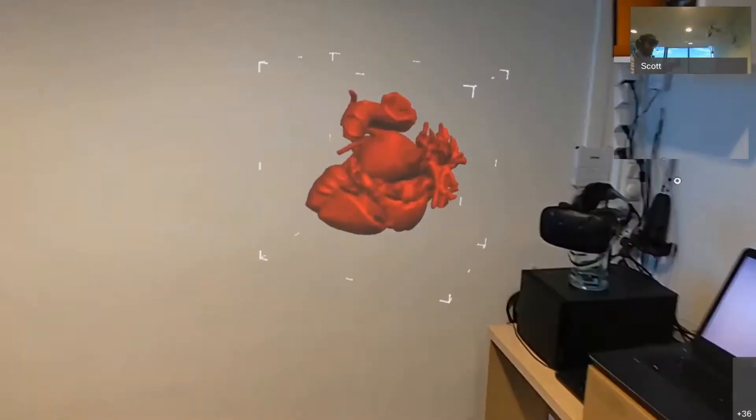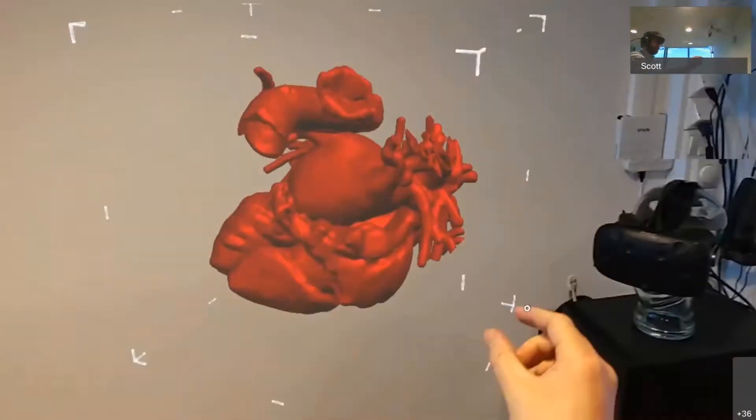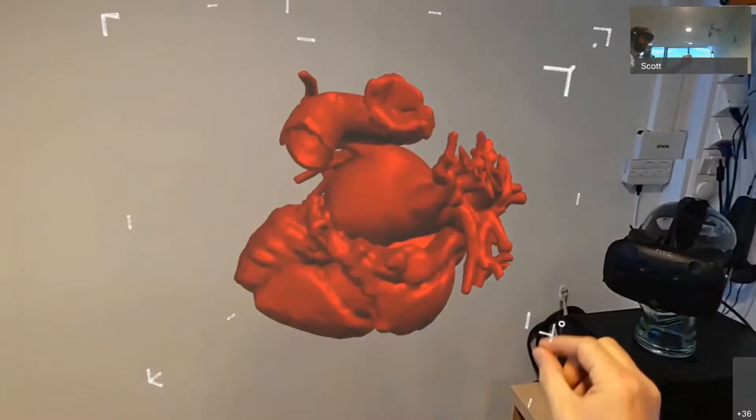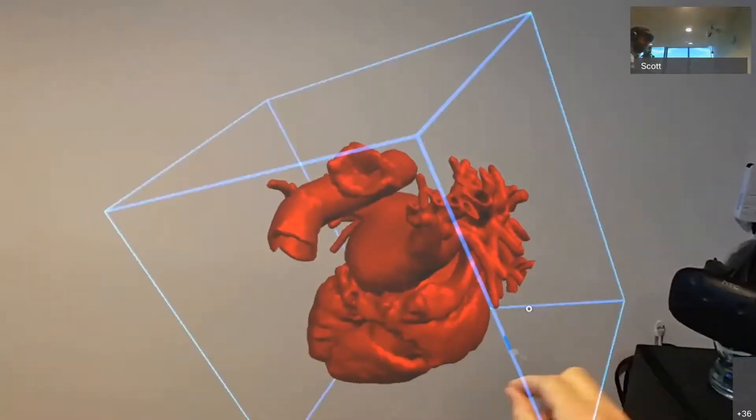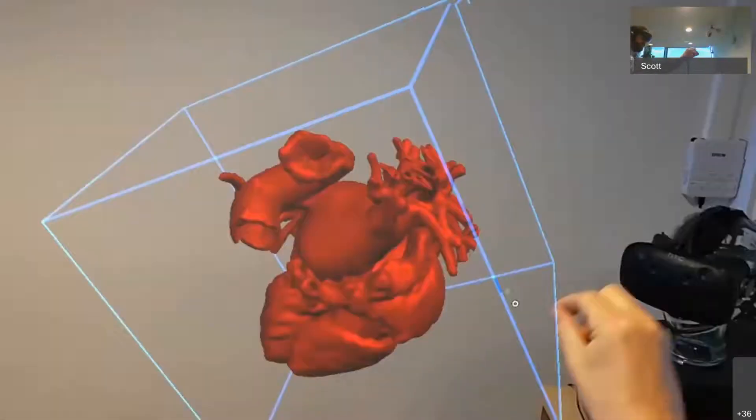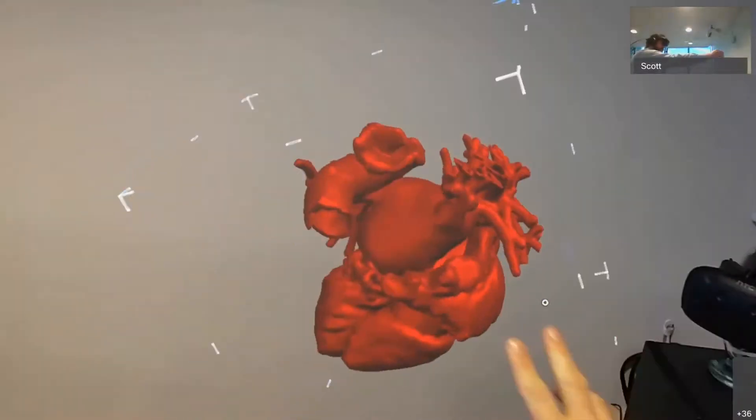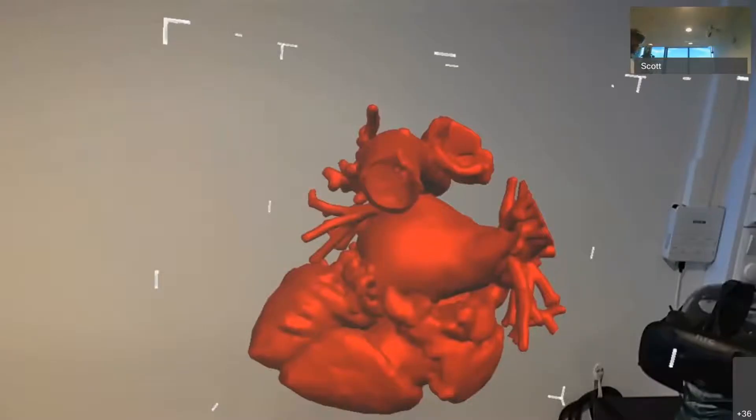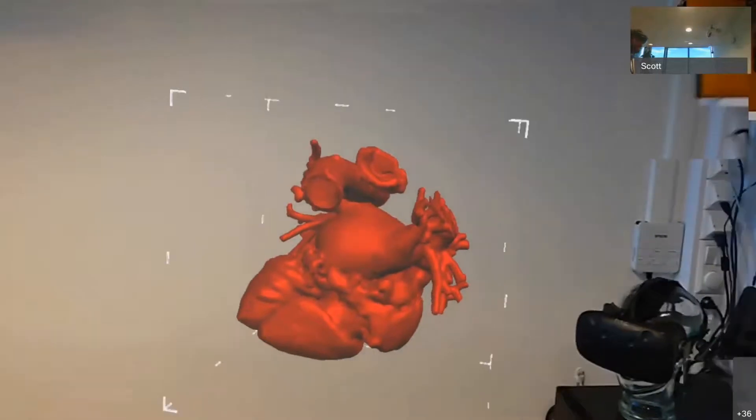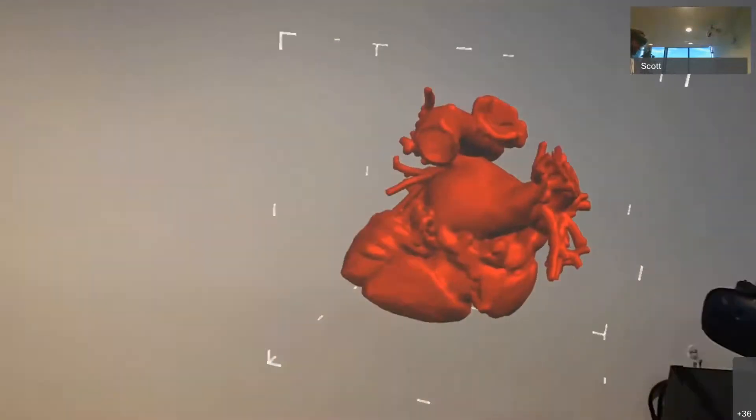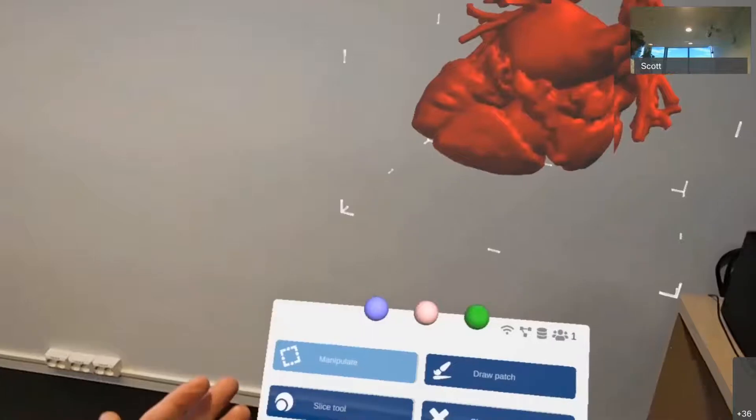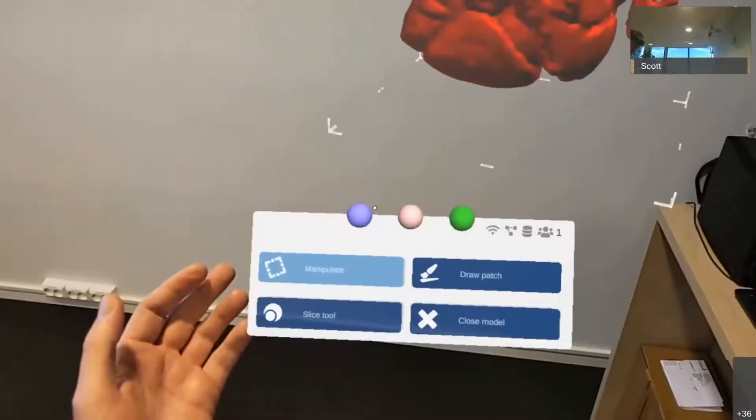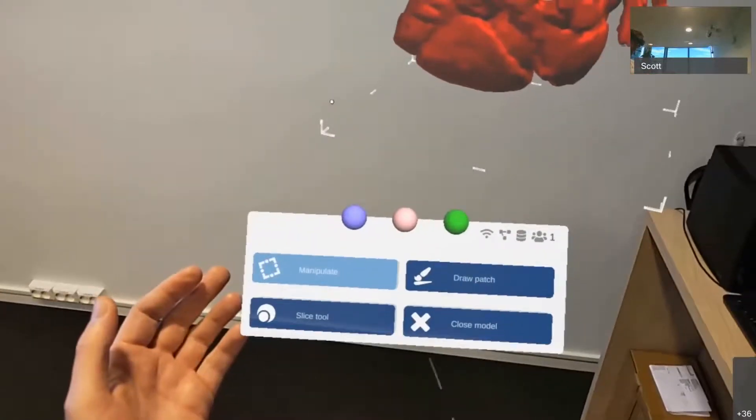And if I want to rotate it just around one axis, I can grab the corner of the Manipulation box, rotate it like that as well. But this looks good. And so now I'm interested in seeing inside the heart, seeing the internal. So I'll bring up the context menu again. And I'll choose the slice tool.